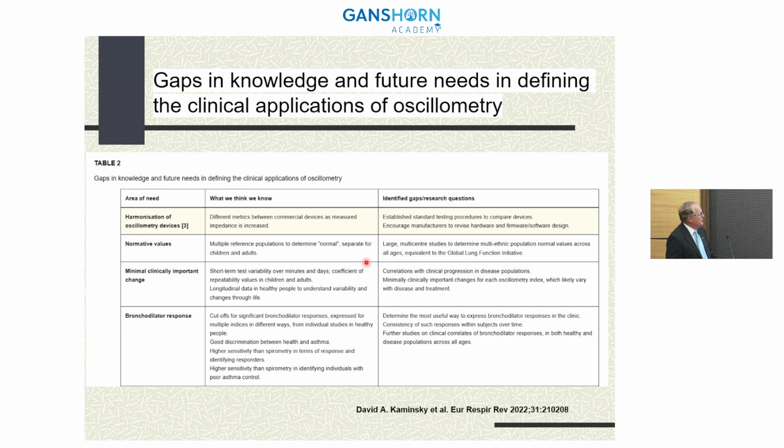And then whether it be bronchoprovocation and or bronchodilation response, we need to have cut points that we are certain of. I think we are definitely closer to that than we've ever been before, and looking at responses of 40% in resistance and 50% in reactance as far as a response, including the variability of the measurement and the other influencers that may impact that response.